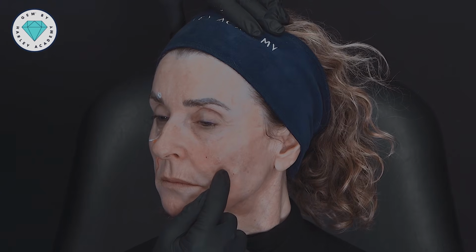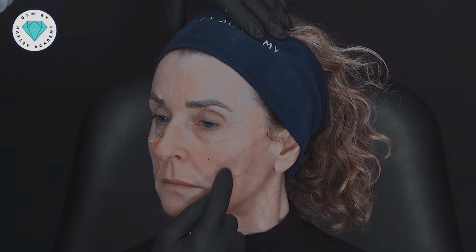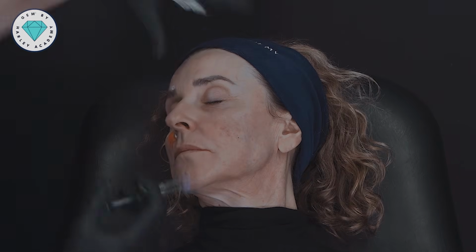What I noticed though is that there is another area, what we would call the deep lateral cheek fat, which I think we also need to treat. Yeah. Okay. I think both of those deep compartments require volume to create the best aesthetic outcome. So let's do another injection, head back. We'll go for 0.2 mils in the deep lateral cheek fat as well. Head this way.